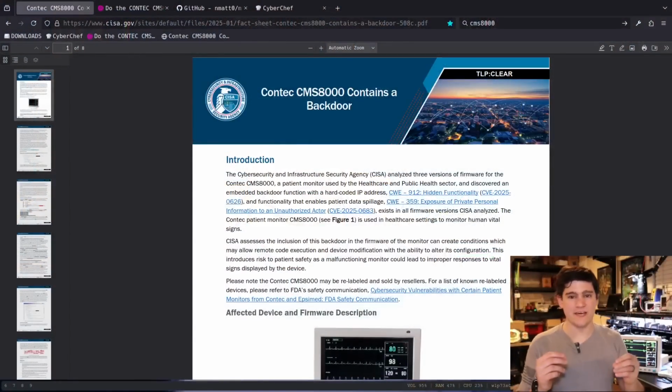Today, over on my workbench, I have the Contec CMS8000 patient monitor. This is a device that is used in hospitals to monitor and alert on patients' vital signs. It is very critical that there are not security flaws in this, but it has recently been the center of controversy over whether or not there is a Chinese backdoor in this device.